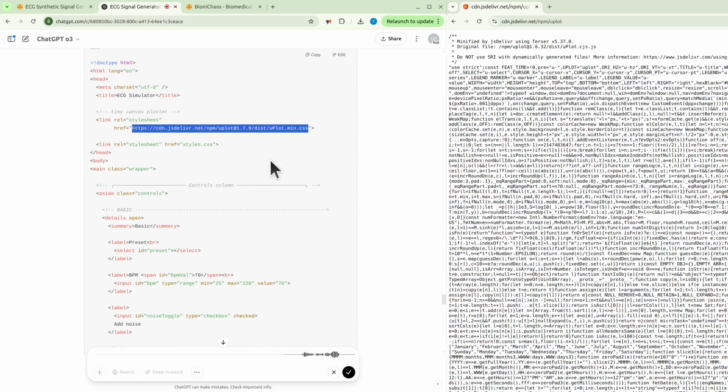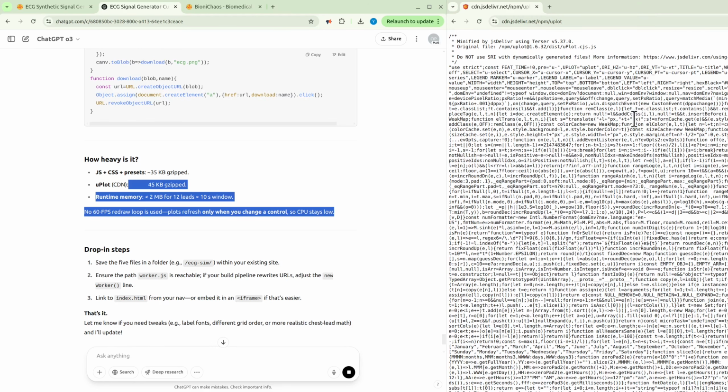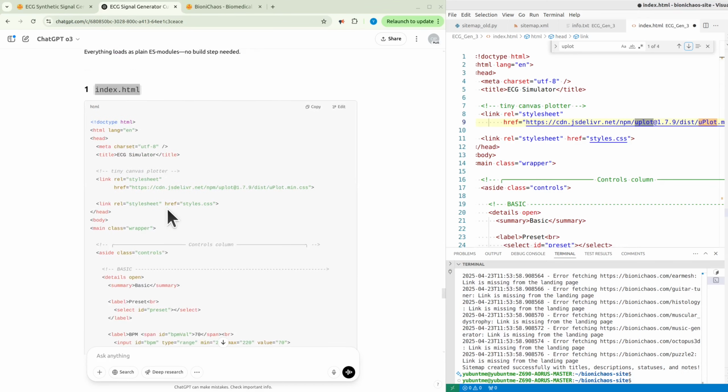Okay, I'm not sure about the uPlot version. There's a problem that the link is not available. Can you check if everything is correct and update the code? Currently, if you go to the basic npm uPlot link, it gives a version of 1.6.32. Can you check that? It's actually giving a newer version. For whatever reason, should we just have uPlot locally? There's also a question: should we download these dependencies, like uPlot, or just use the most recent one or specify a specific version? It went for 1.7.9. We have to change that.